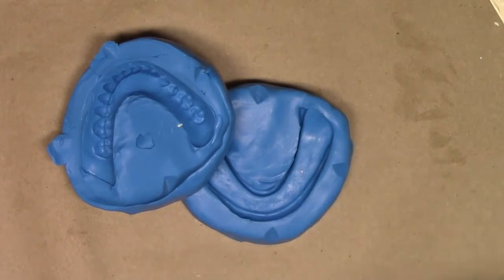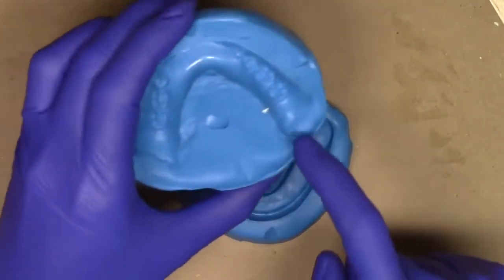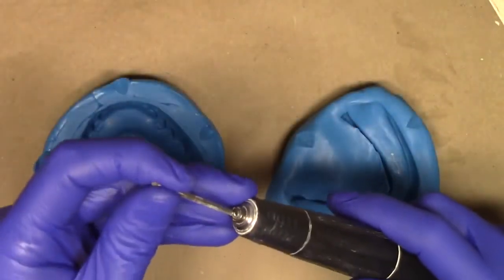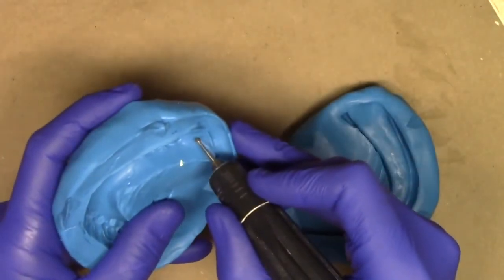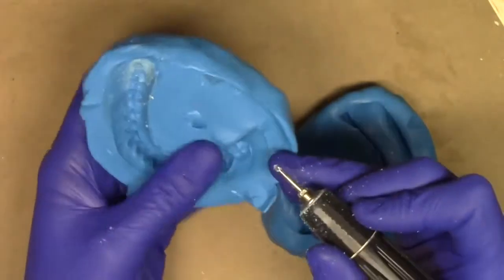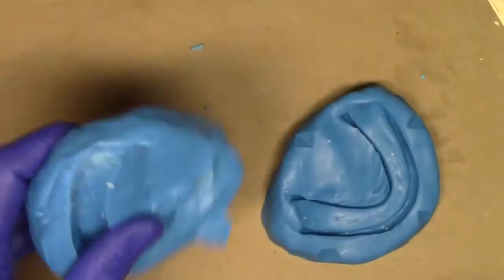What we need to do is we need to go ahead and place a couple of holes on the intaglio portion of this complete denture, so that way we can create one large hole and one medium-sized hole into this space. What I like to do is to take a laboratory handpiece with a round burr, and I'm going to start by preparing one single hole in this area just like so. And you punching through all the way until you come out on the other side. And the same thing here until you come out on the other side.